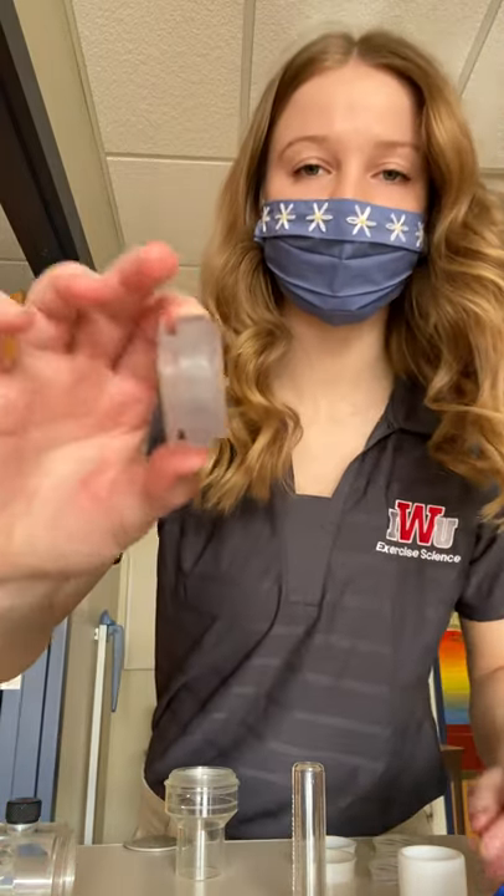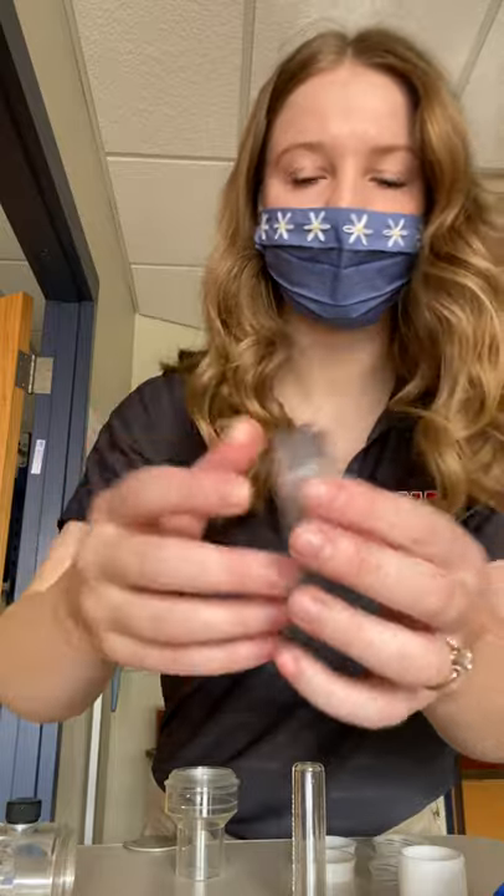You will start by taking this piece right here and placing that into this part of the center valve. You'll screw it in there.